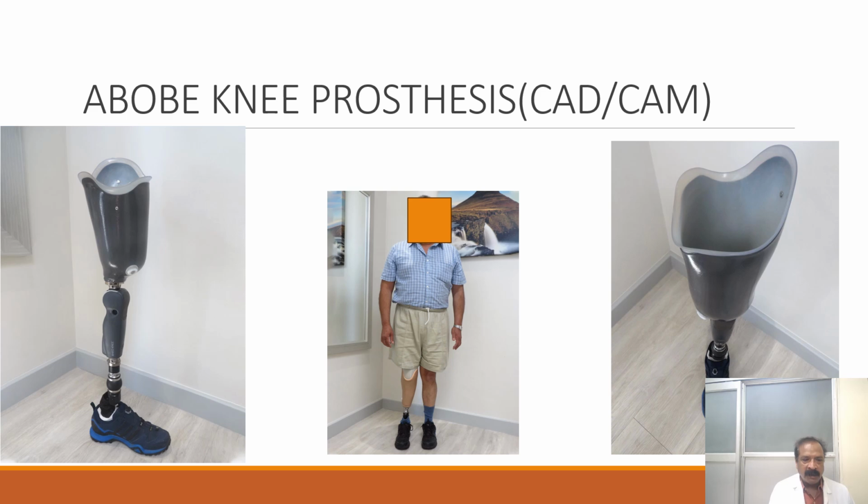So above knee prosthesis, socket, you can see a prosthesis fitted to the person. It is a very technically demanding subject, because prosthesis fitting causes so many complications. If you do not measure perfectly the stump, socket preparation, and length of the prosthesis, then after an amputation the prosthesis fitting is not easy. You have to go through various types of trials. Materials are also highly essential for the treatment with prosthesis.